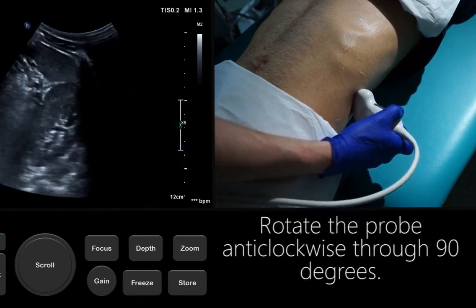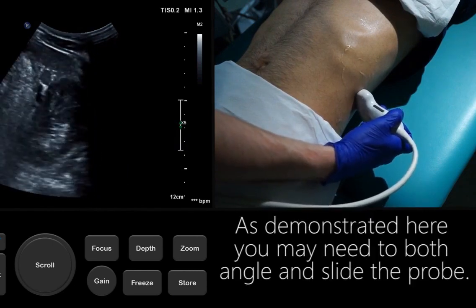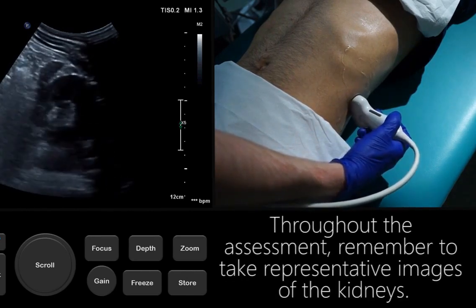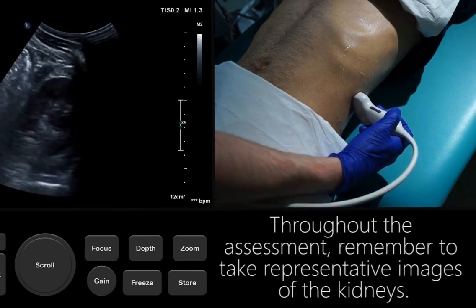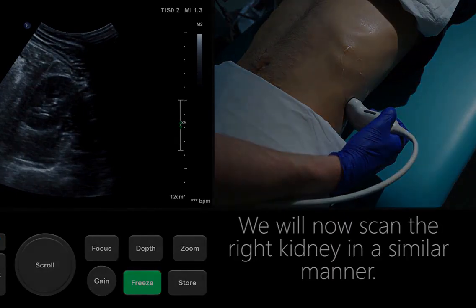Rotate the probe anticlockwise through 90 degrees. Assess the whole volume of the kidney. As demonstrated here, you may need to both angle and slide the probe. Throughout the assessment, remember to take representative images of the kidneys. We will now scan the right kidney in a similar manner.